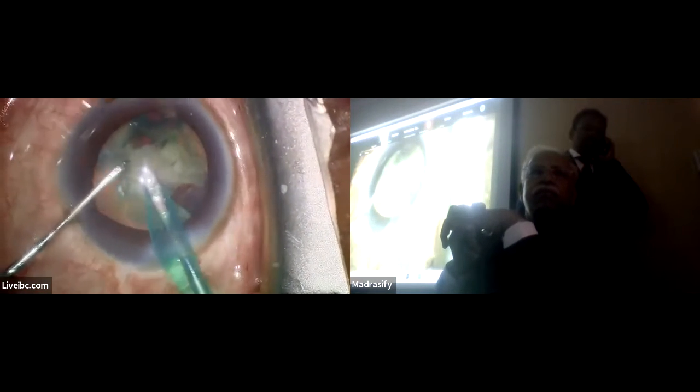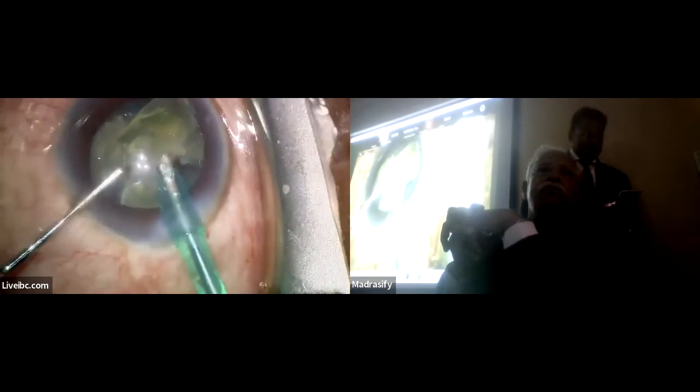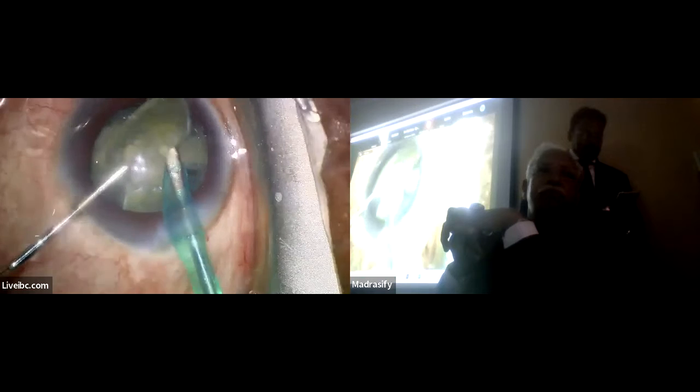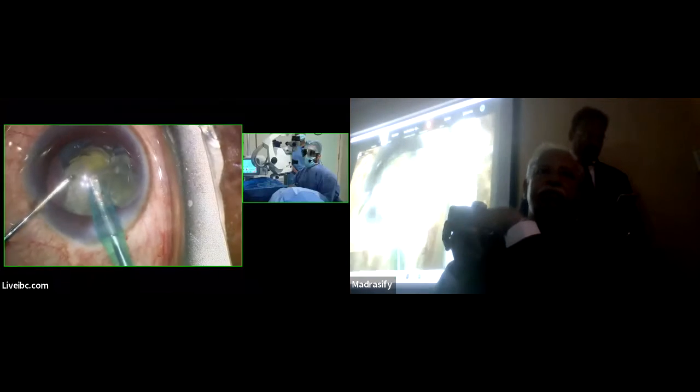Loading cart. Lens loading cart. Cartridge loader. You need to load the cartridge. You are going to load the cart. Parameters down.